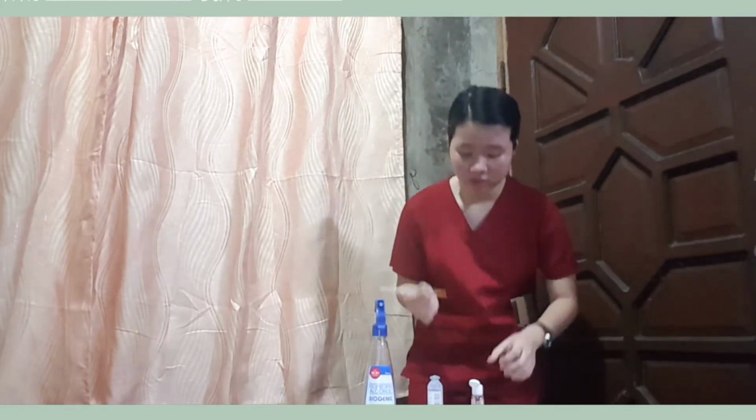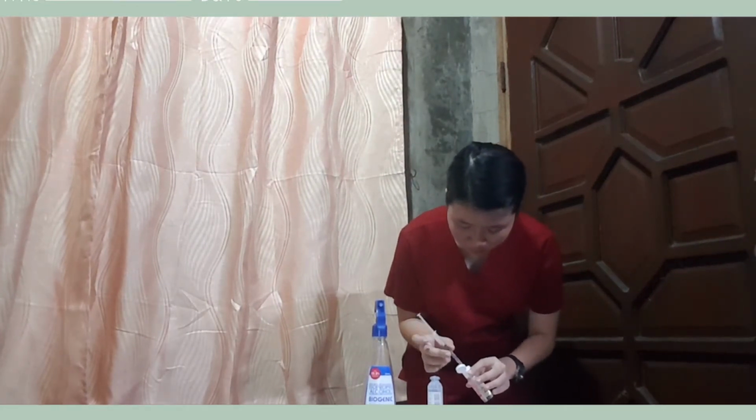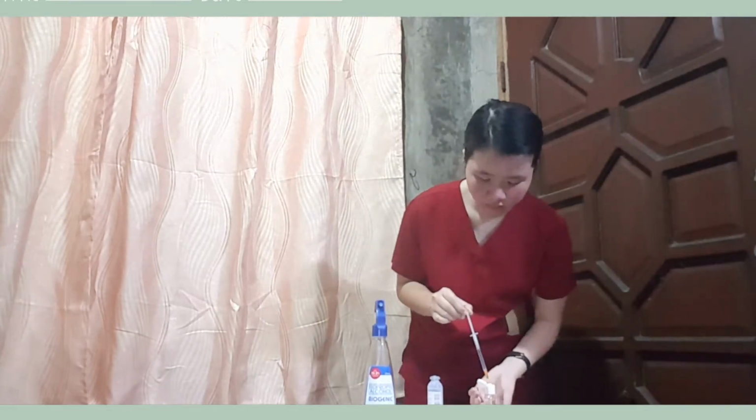Now we are going to withdraw the ordered amount of intermediate insulin. This is to ensure safety and appropriateness. And now we need to proceed to procedure number 14, which is to remove the excess air until you see a small amount of insulin on top of the needle. This ensures that the correct dose of medication is being taken.